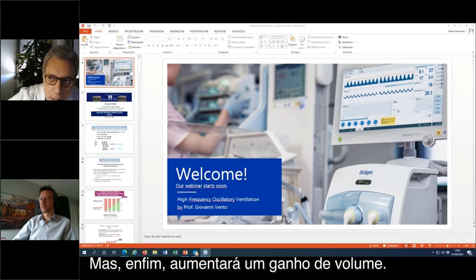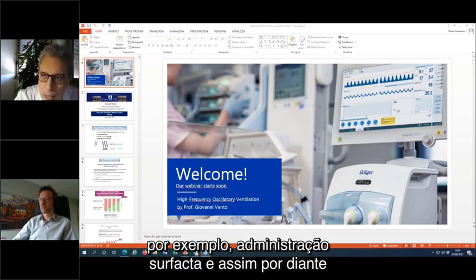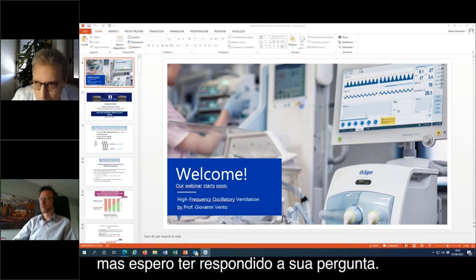But anyway, you have gained an increase in volume that will also favor, for example, surfactant administration and so on. I hope to have replied to the question.